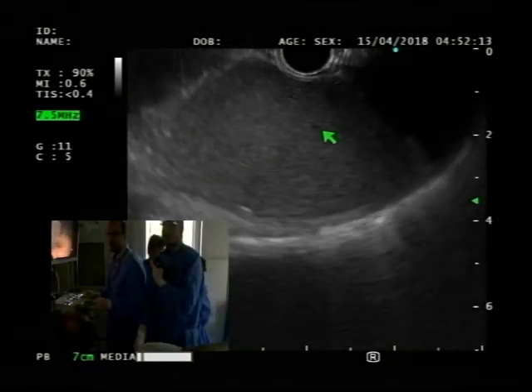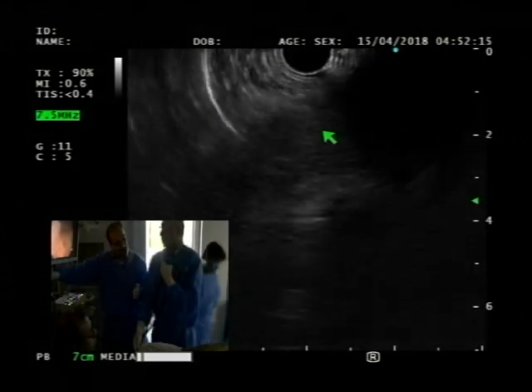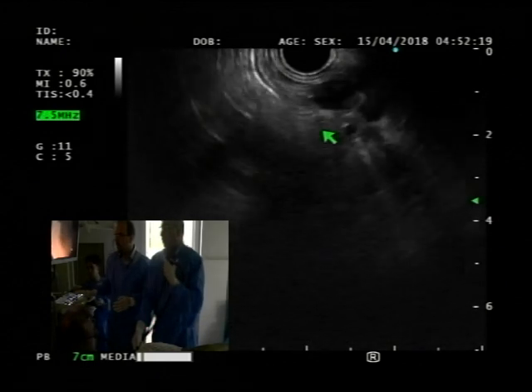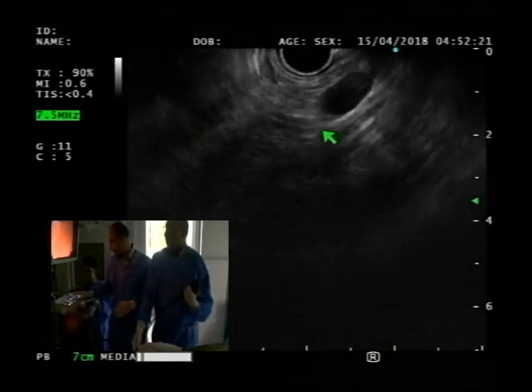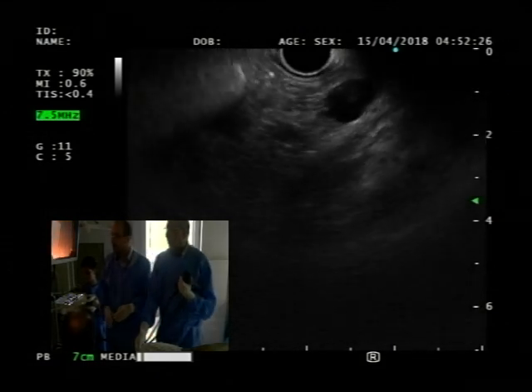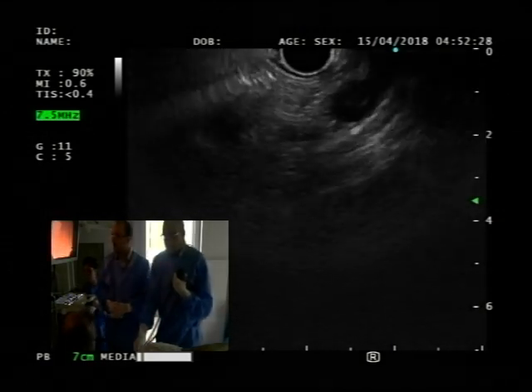So you're now really going clockwise. That means you have spleen. If you go counterclockwise, you will get away from the spleen. You need to get the aorta. So see if you can find the aorta again.